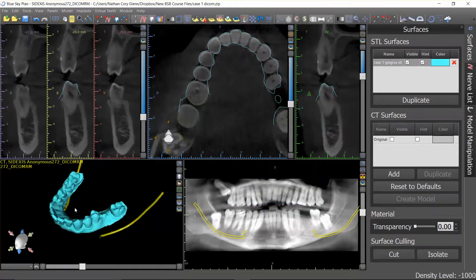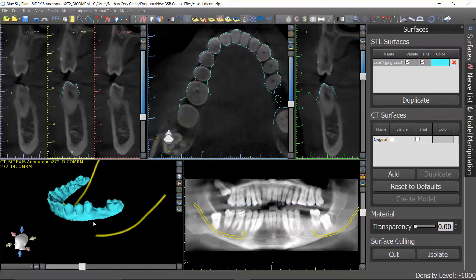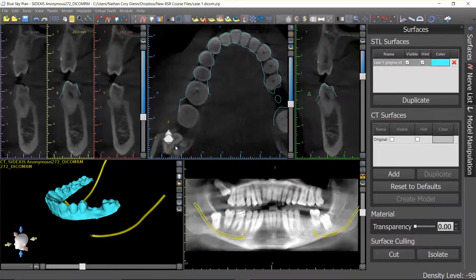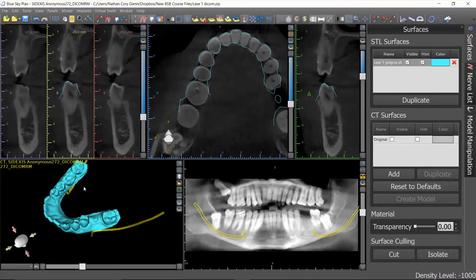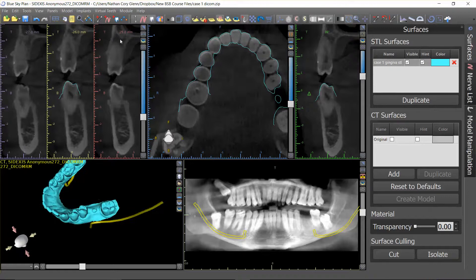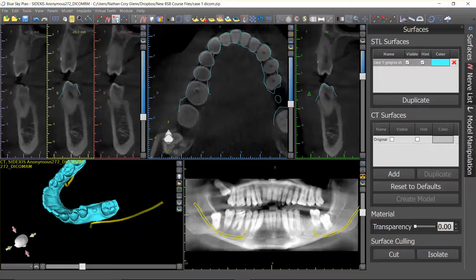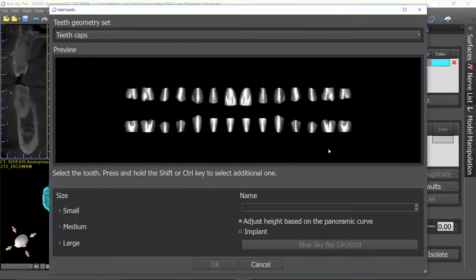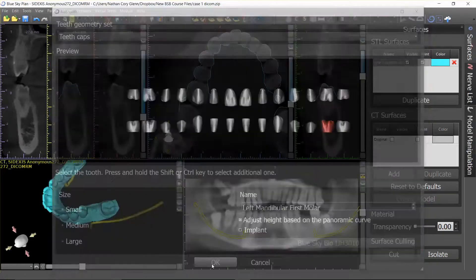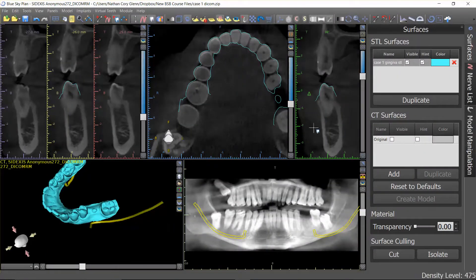At this point we need to do prosthetic treatment planning. We want to put a prosthetic tooth in there so that we know what the end restoration should be emerging through. I'm going to click on add tooth. When I do that this menu will come up and I'm going to choose the particular tooth I'm using — we can go with medium, that's fine — and click OK. This tooth can be dropped into any of the windows: the pan, the 3D. I'm going to drop it into the pan view.